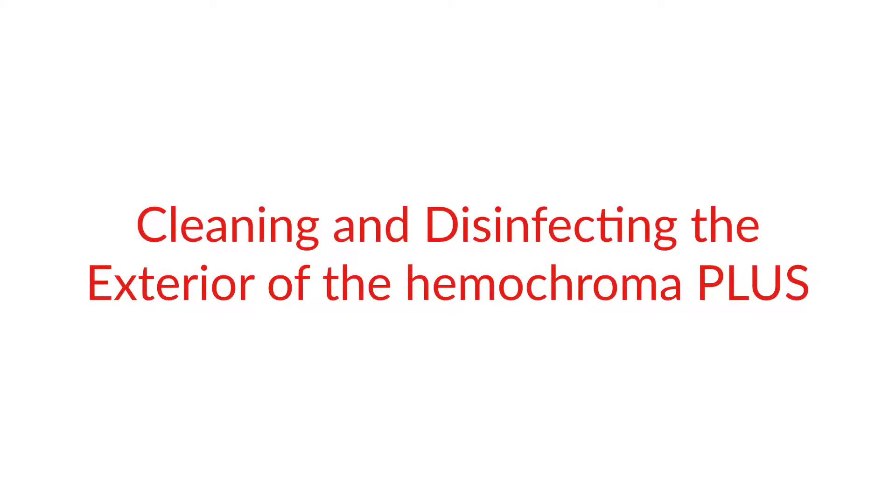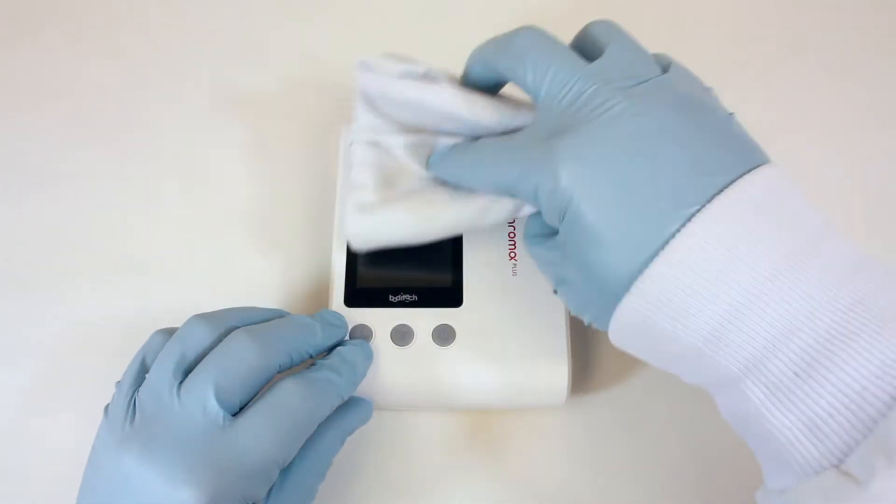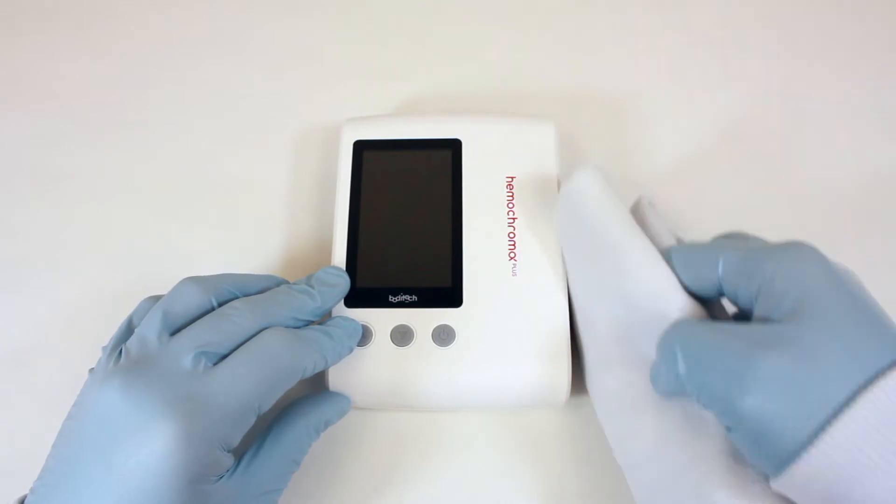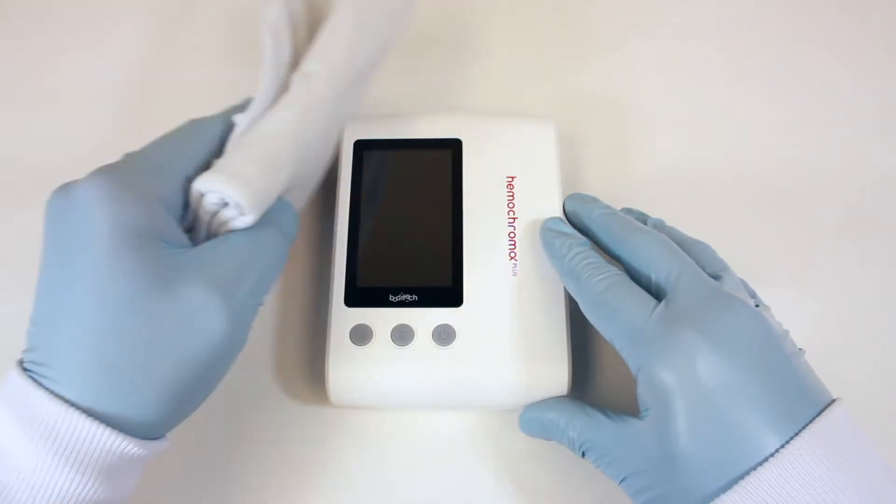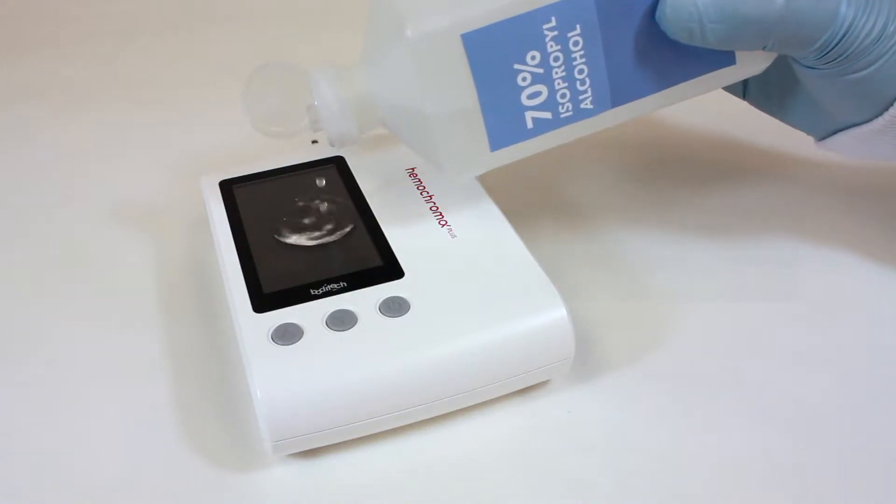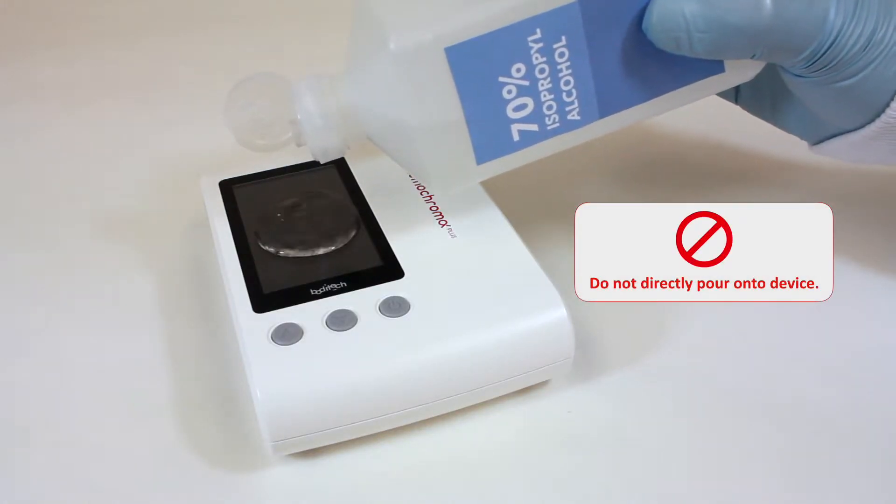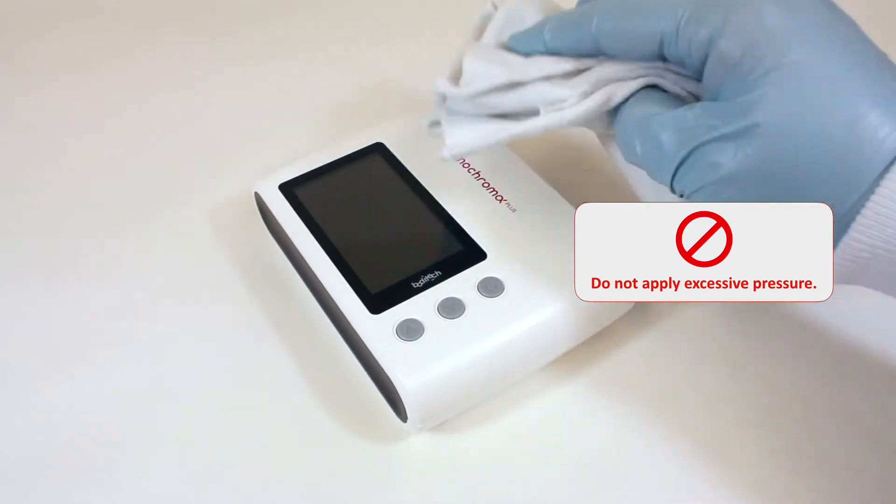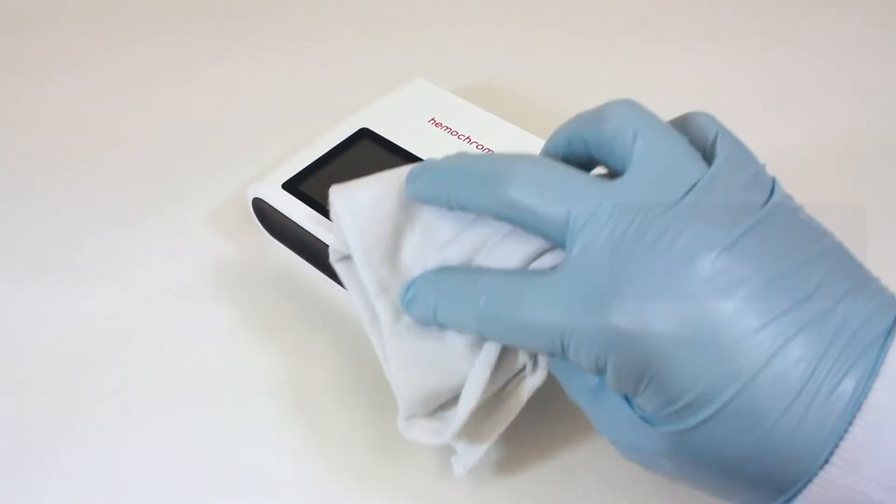Cleaning and disinfecting the exterior of the Hemochroma Plus Analyzer. Clean the exterior of the analyzer daily with a soft, clean cloth lightly dampened with mild detergent or 70% rubbing alcohol wipes. Do not directly pour detergent or rubbing alcohol on the device. Avoid applying excessive pressure when cleaning the surfaces.